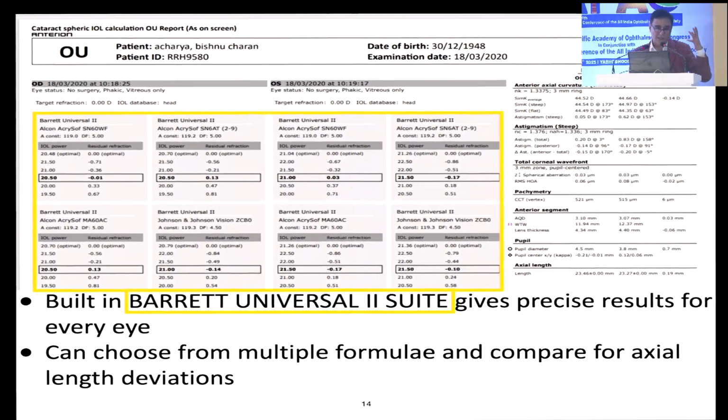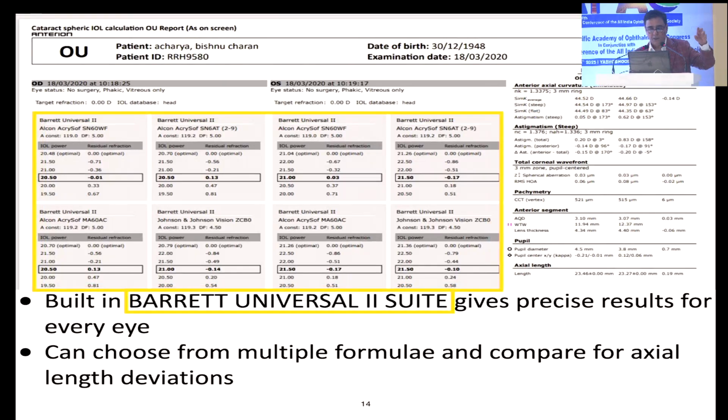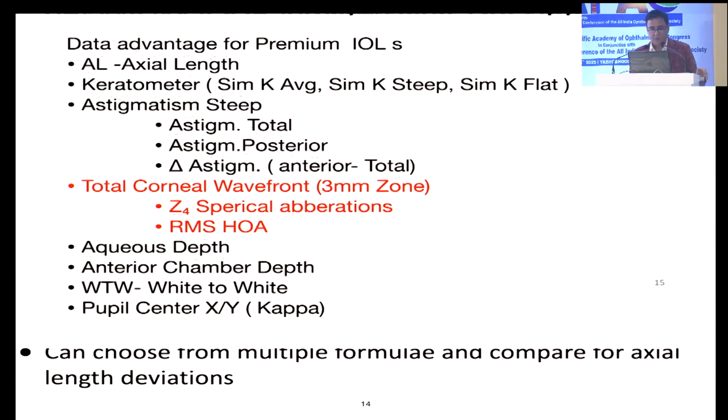And of course, it has a Barrett built-in suite, and now we all know that we are using the Barrett 2 universal, and you can put multiple formulas here. So you can see I put an SRK2, Barrett, and you can put whatever you want. You have 4 options, and 4 calculations will pop up at the same time.